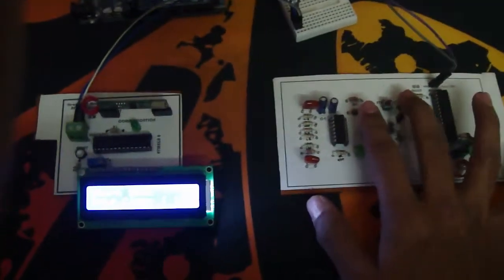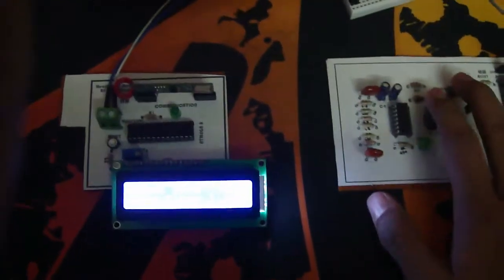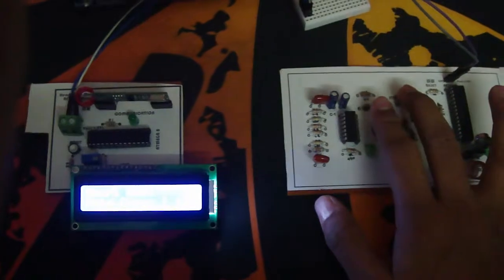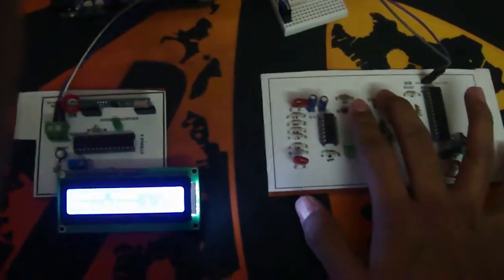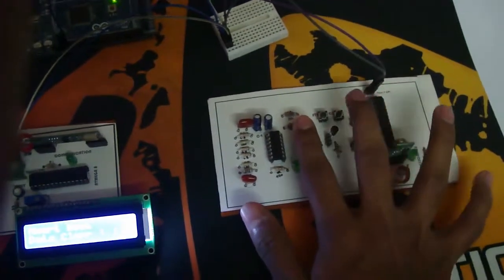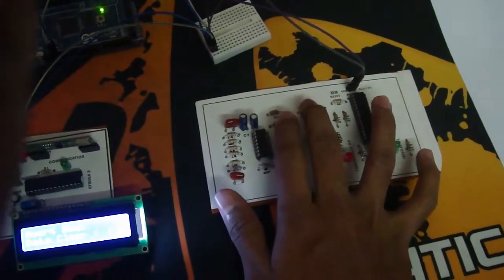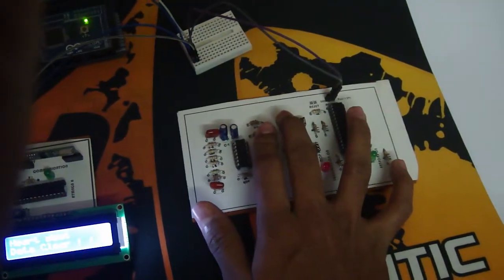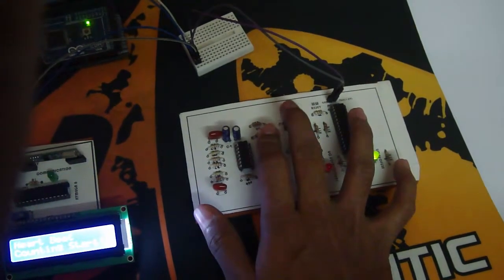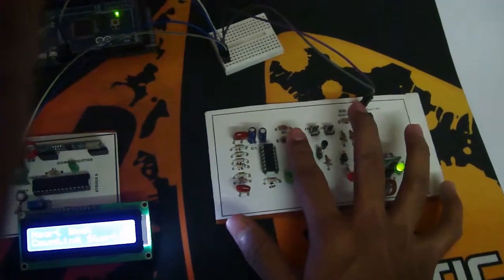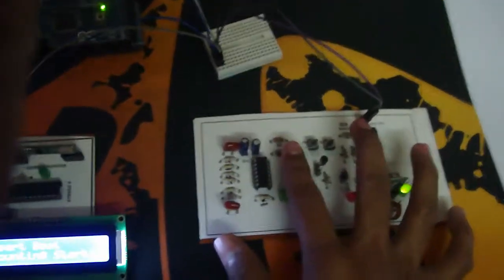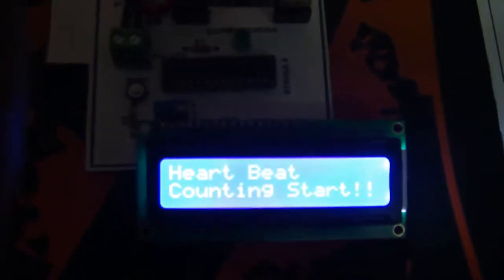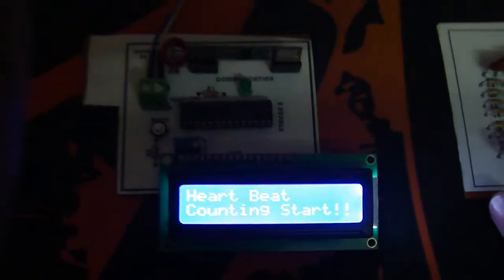You can see the LCD. When I press this button, the red and green LEDs light up. It just transmitted the 'Counting Start' message.